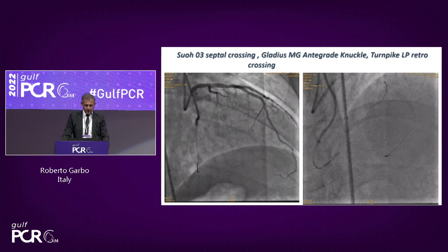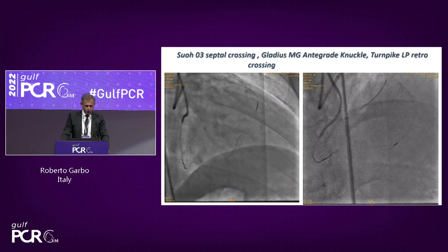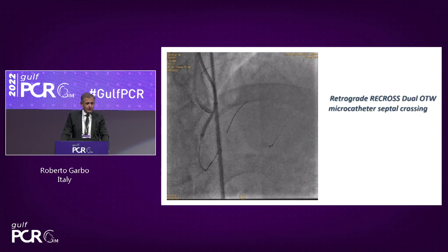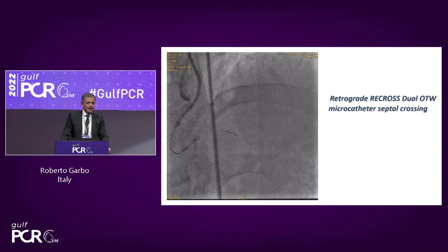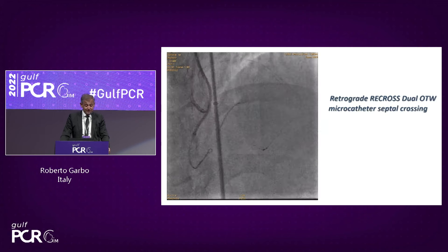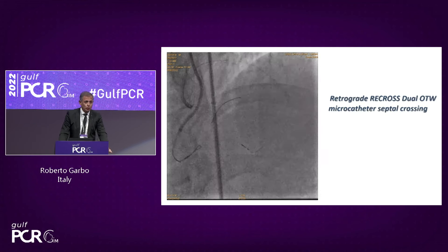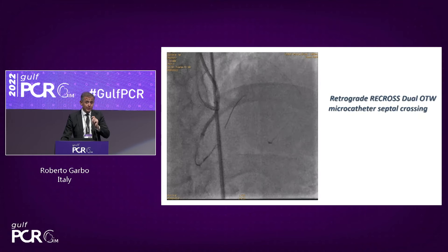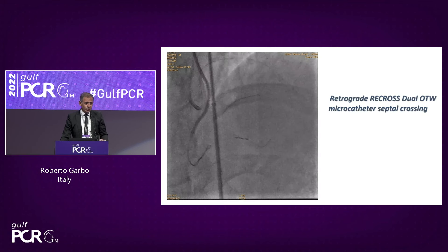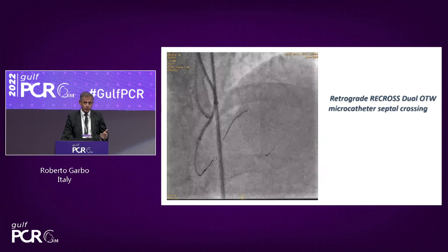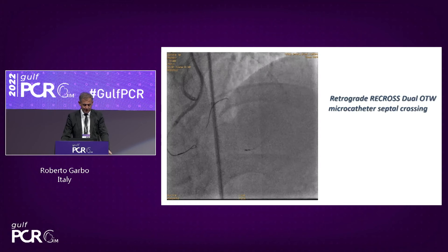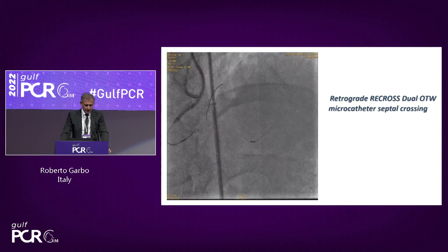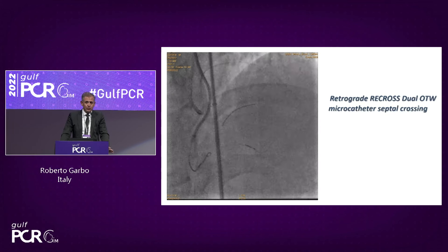We have the Gladius Mongo antegrade and the Turnpike LP with SWO 3 in the posterior branch. I had a problem with the puncture — I removed the SWO, tried to puncture with the Gaia, but had no way to puncture because it was not stable. I decided to leave the SWO on the posterior branch and take a dual-lumen microcatheter from the septal — the Recross, a new dual-lumen over-the-wire device with two lumens allowing two wires simultaneously. Advancing the dual-lumen retrograde through the septal required no contrast at all.